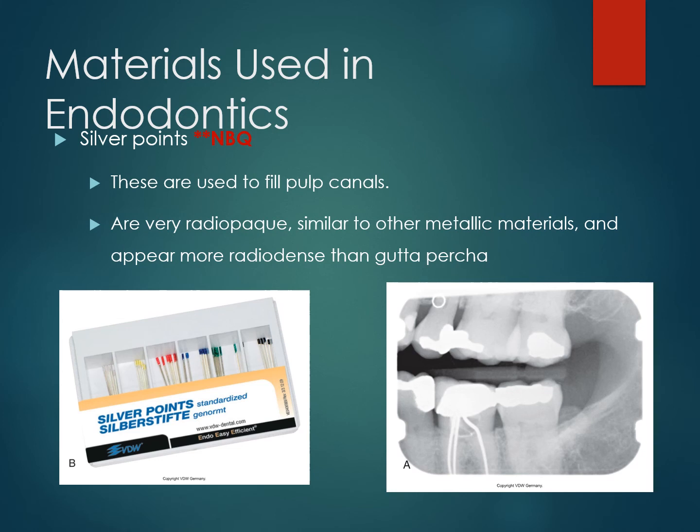They went down really easily, but because you're able to push, you were able to actually puncture through where the apical region was and down into the bone without knowingly doing that, without having any of that tactile sensitivity. So they were very hard to seal the tooth off from the surrounding structures when you used silver.